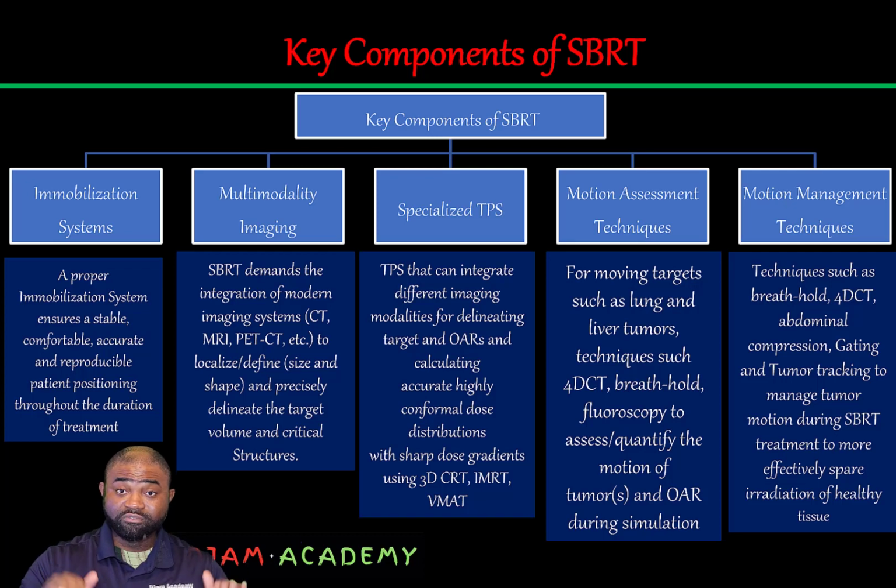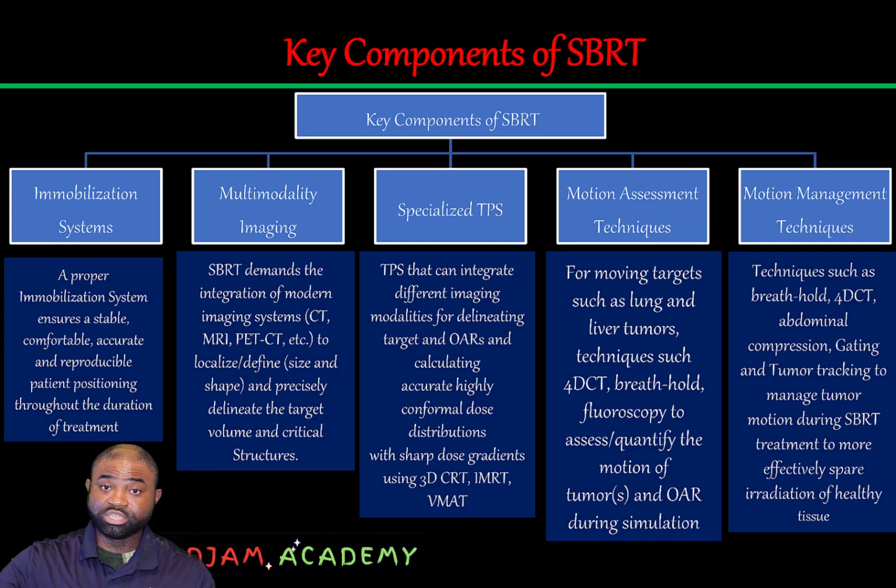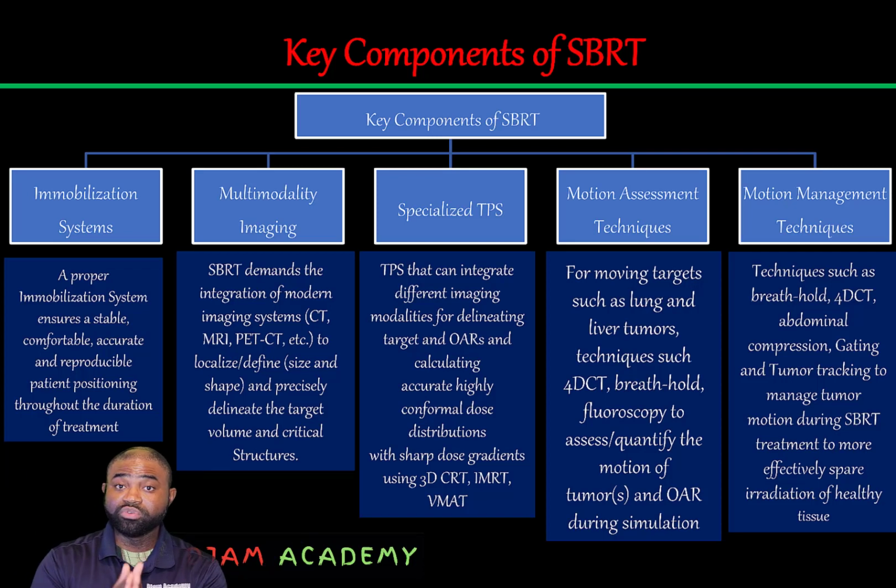They are all very essential. The absence of one means the failure of the entire process. And so to start from CT simulation, the very first, we need a robust immobilization system. In order to ensure high accuracy and precision in the delivery of stereotactic procedures, we need a robust immobilization system.